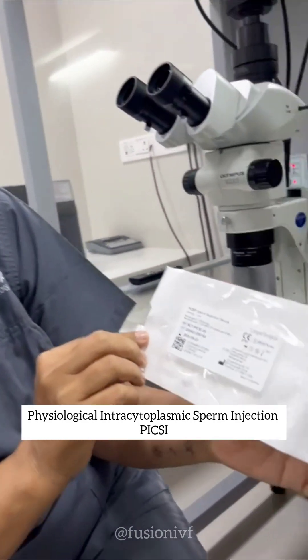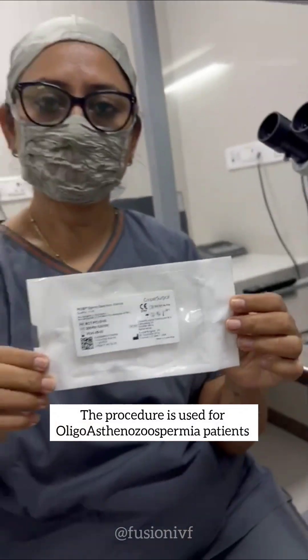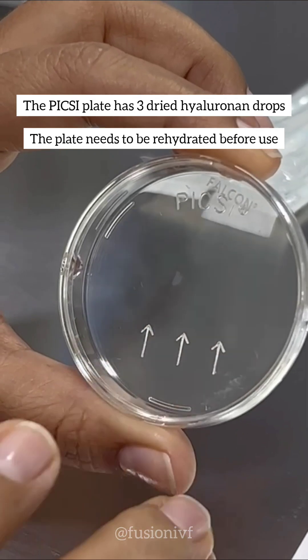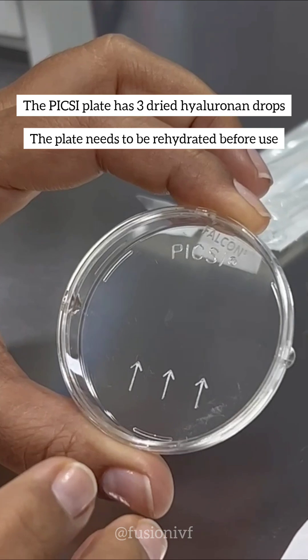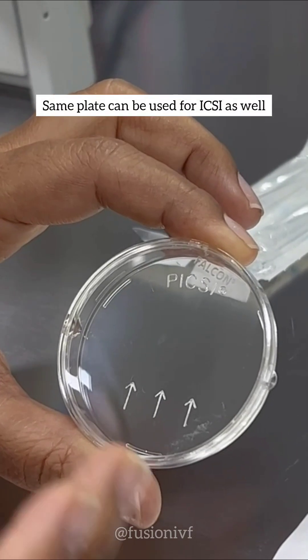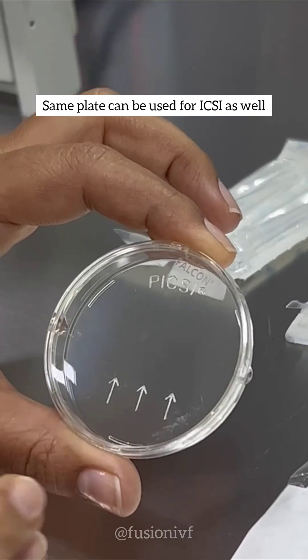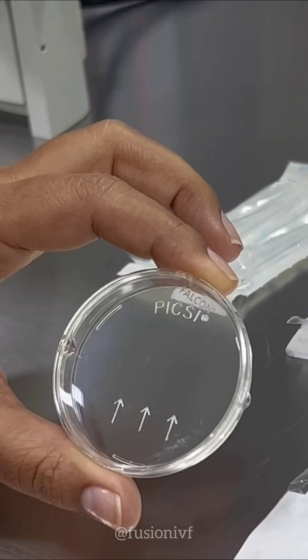This is a plate which we got from Cooper Surgical and we are using it for an oligoasthenospermia patient. This PIXI plate has three hyaluronan drops — dried hyaluronan drops which we have to rehydrate 15 minutes before we use it and before we load the sperm. You can also use this same plate for ICSI.